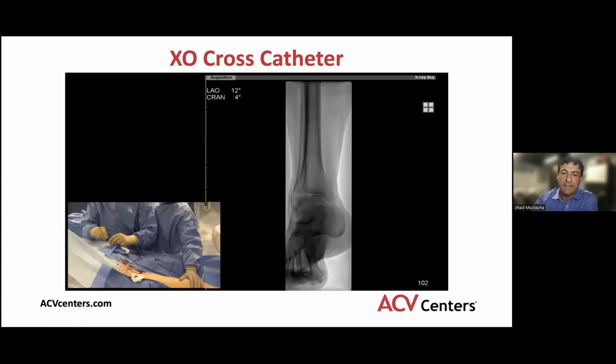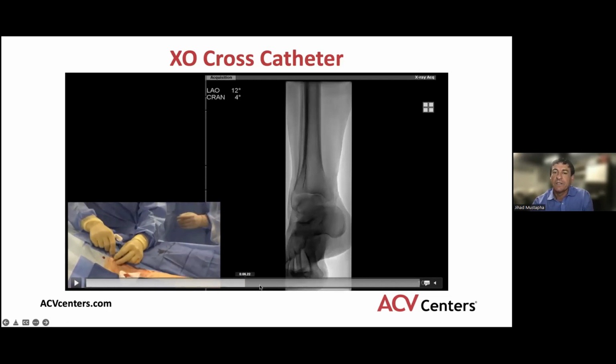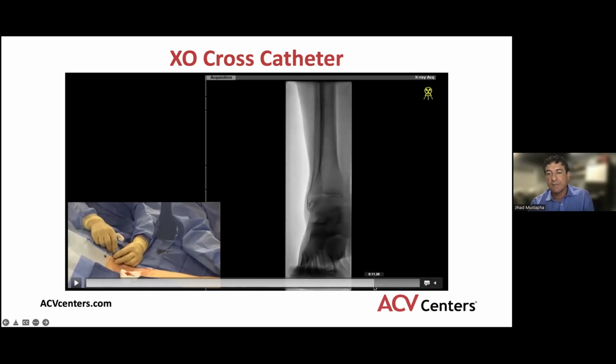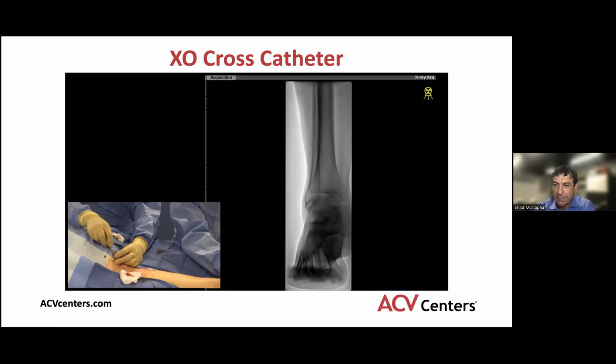We're using the Exocross catheter here to go down and take a look at the different anatomical areas in the foot, to decide whether further evaluation or treatment of the posterior circulation or anterior circulation is needed. The catheter actually went down very smoothly all the way through the high-grade calcified stenosis in the SFA and popliteal, and went nicely all the way down into the pedal circulation. This isn't shown very well, but it had no problem going into the pedal loop.